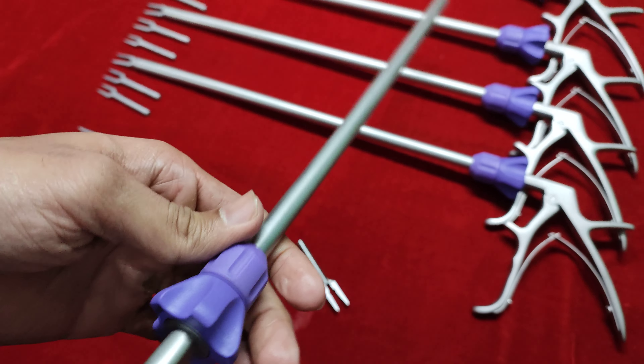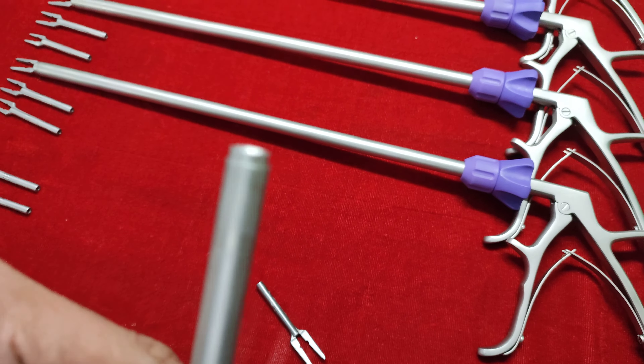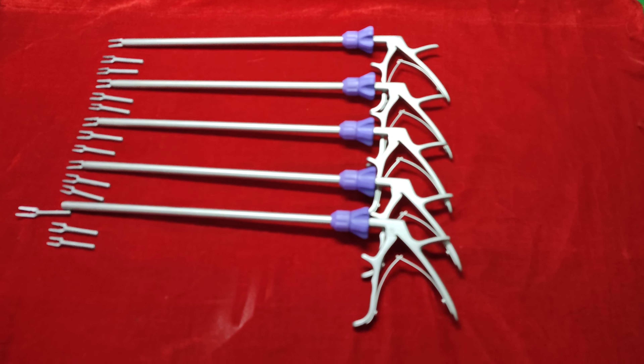Hi, this is Ajay Kumar from Rudra Surgical, Mumbai. We are manufacturer and supplier of laparoscopy, urology and gynecology instruments. This is clip applicator short job, stainless steel with matte finish, size 10mm.